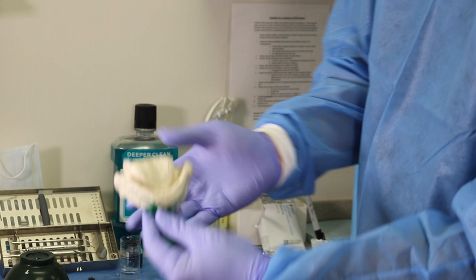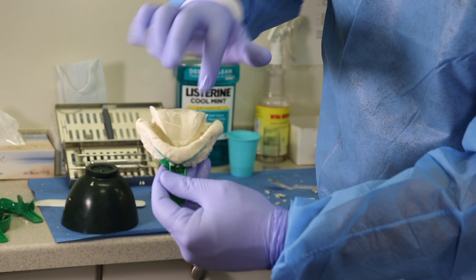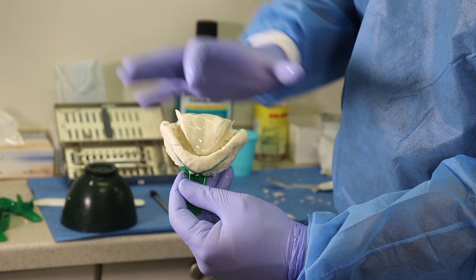This is how a lower impression should look like. Tongue space completely filled with some alginate. Okay? All teeth are enclosed within the tray. And the deepest part of the vestibule is very well copied.